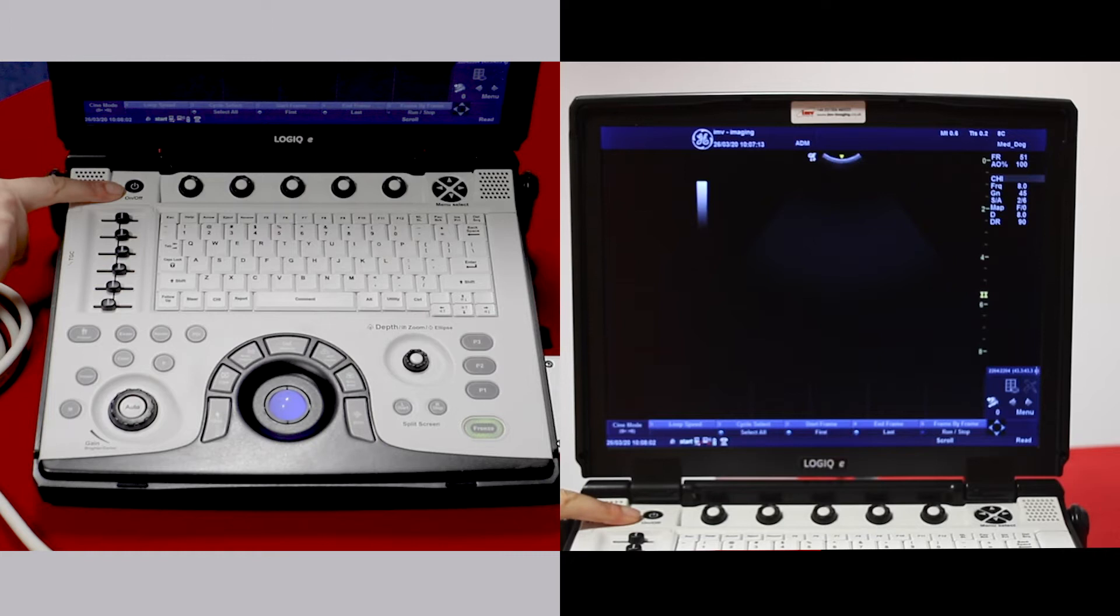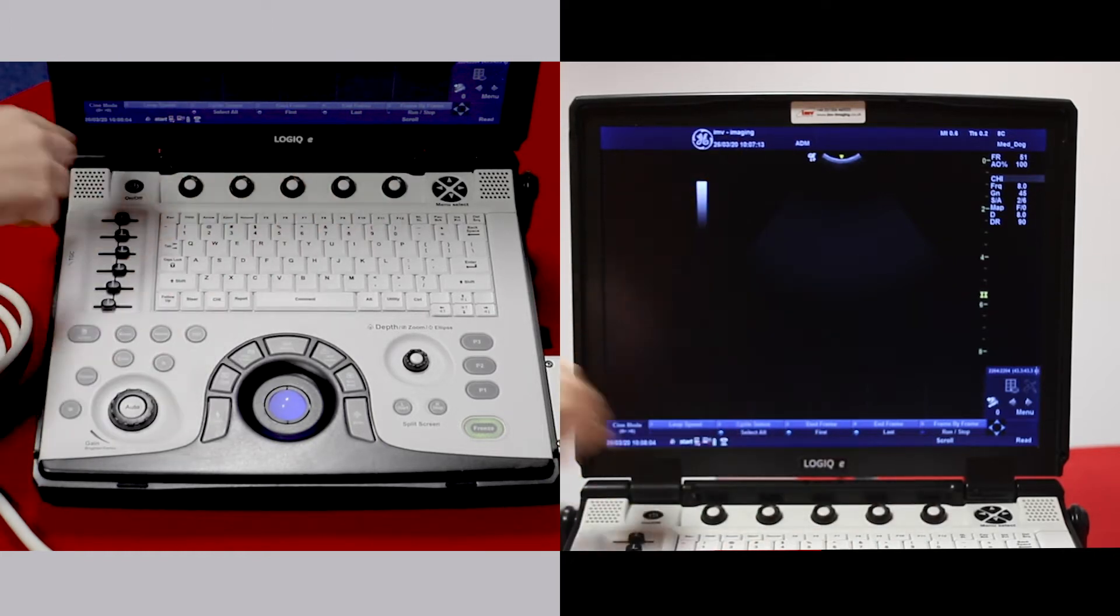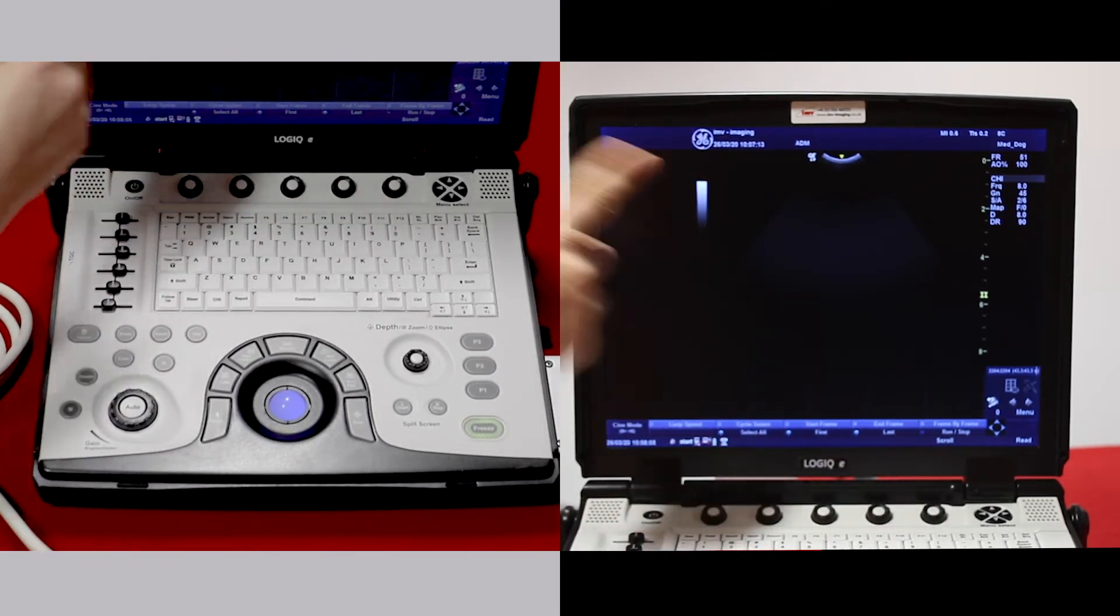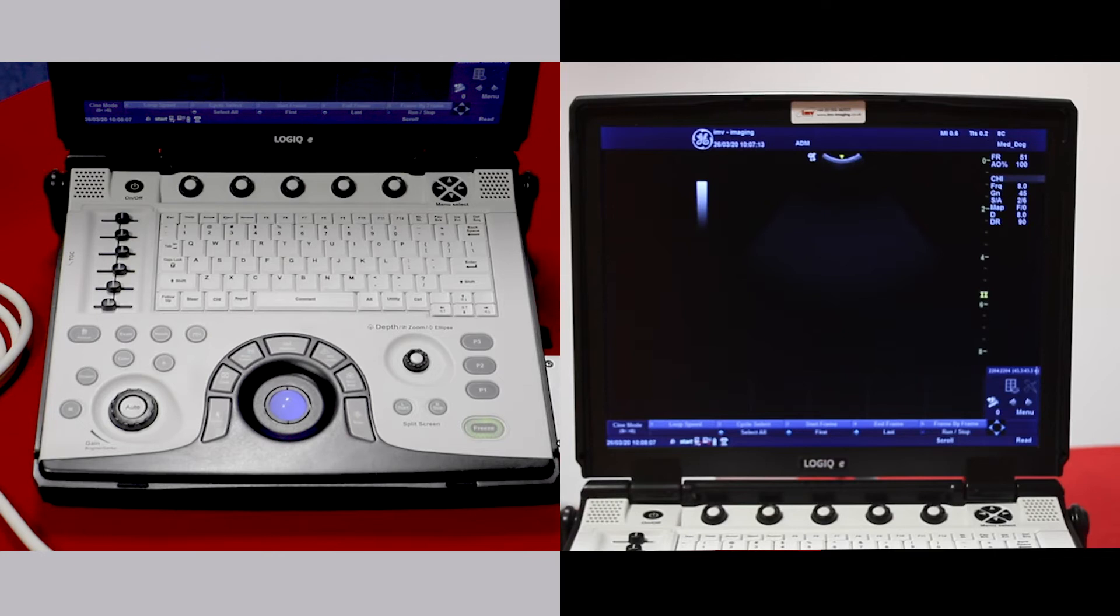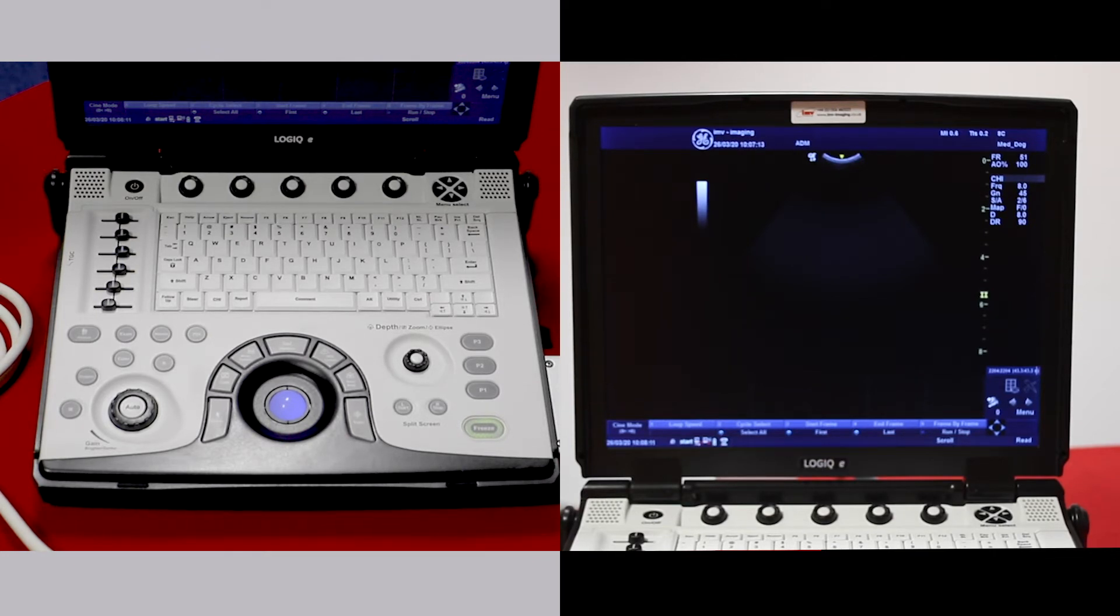When you first put the machine on, you'll be taken to the scan screen. You need to put some patient details in so that any exams you save will be saved to the hard drive to that particular patient.